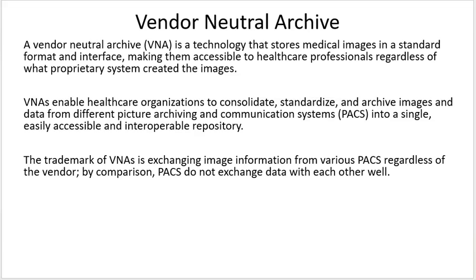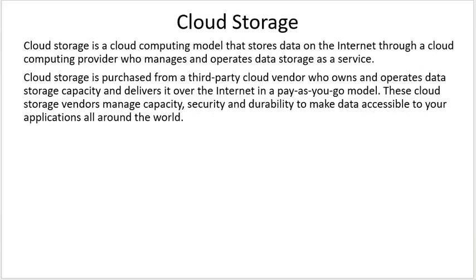But if you buy a vendor-neutral archive, like the HPMA I mentioned earlier, you can dump the images from all of those different PACS systems into the VNA and then share it across the enterprise very easily. So VNAs are very popular. Most places use a VNA because over time they've developed multiple PACS systems, and it's just easier to use a VNA to put all of the data together.